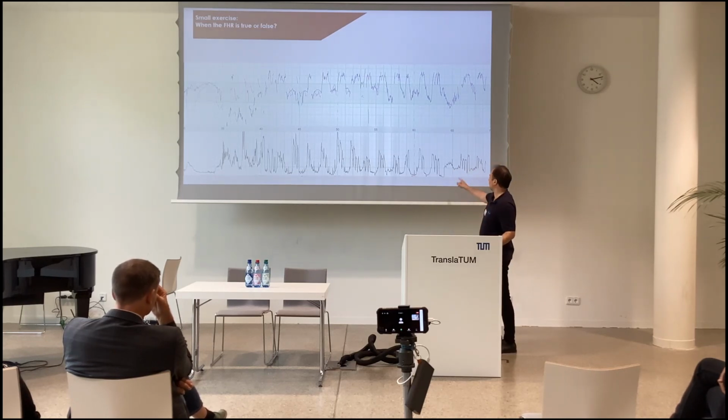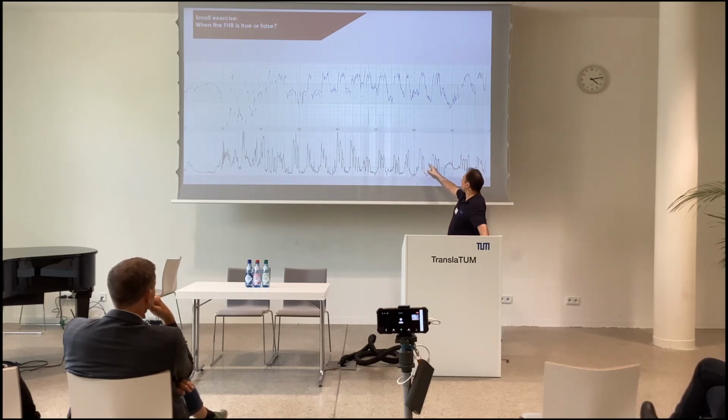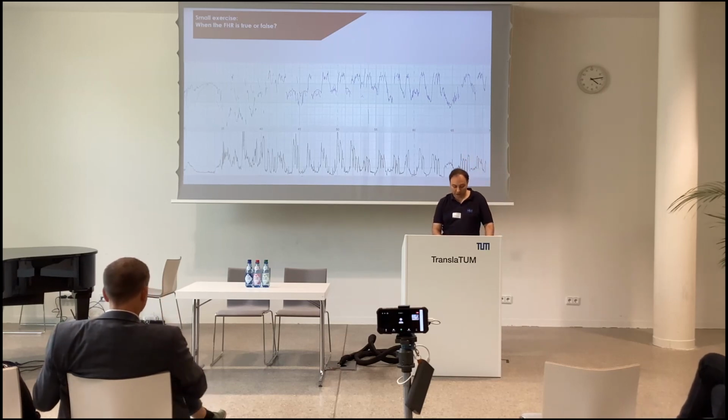that there are maternal accelerations, which are often much larger than the FHR accelerations, and which are perfectly synchronized with uterine contractions, and there are also the 3 bumps on the top, which correspond to the 3 expulsive pushes, which can be recognized and are very typical for maternal heart rate.